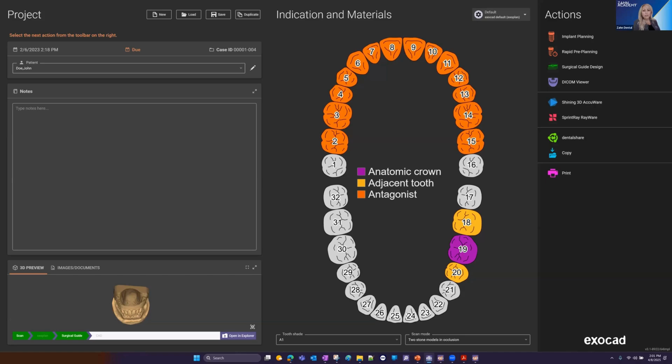Awesome. Next question is, can a guide be designed without sleeves, such that handheld keys like Zimmer makes fit directly in the guide? So there, we do have one of our libraries that you can download. It's actually the exocad library that will allow you to do a custom size hole as well. That would fit the need for what you're asking for.